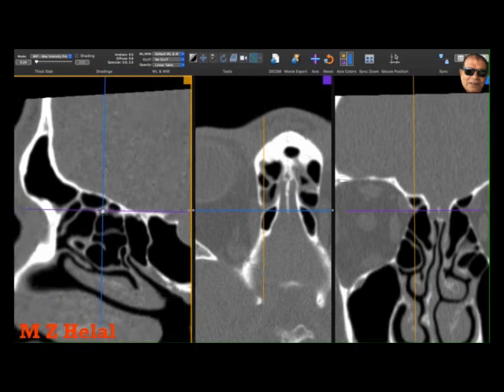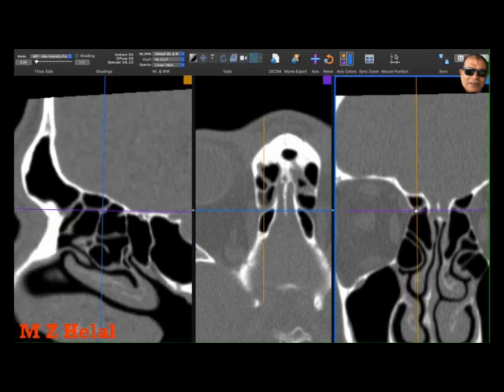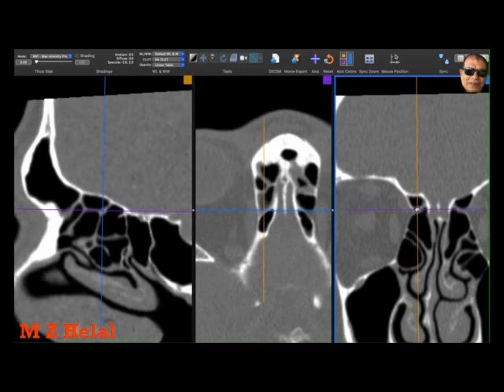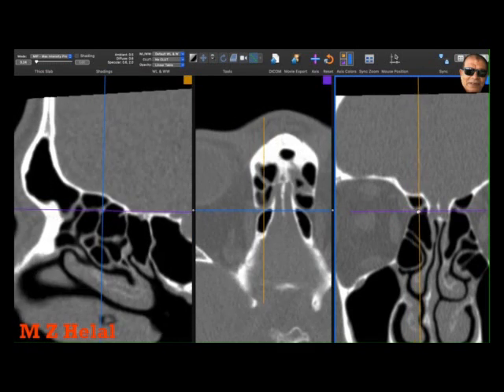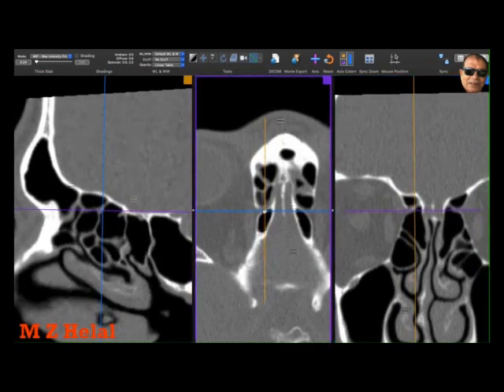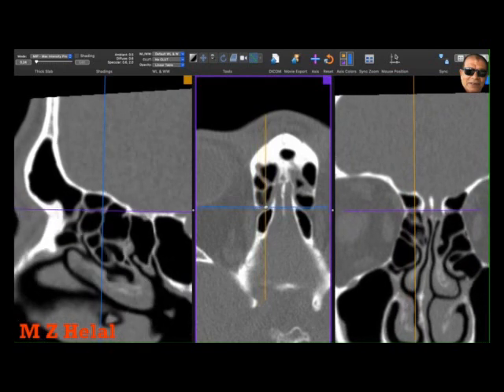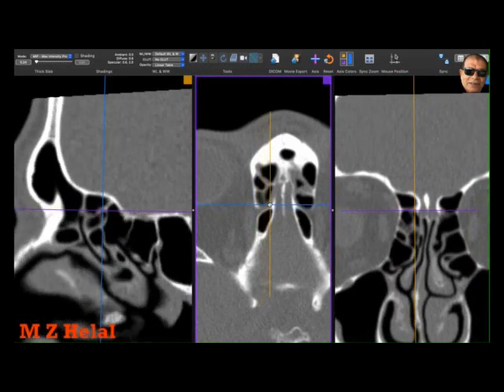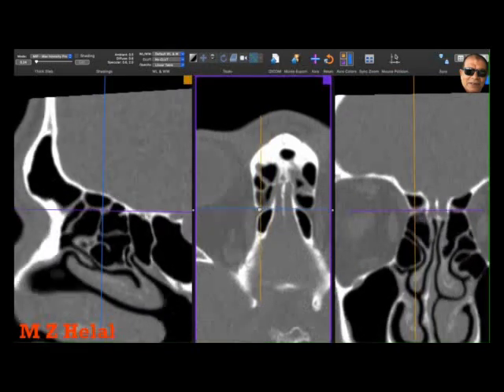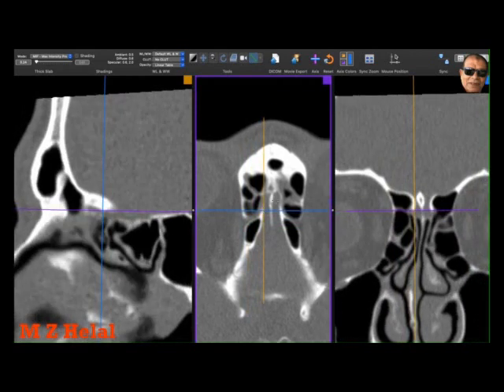This is the site of the anterior ethmoidal artery in a canal on the sagittal, running in a tree-like pattern. You can follow it also on the axial cut, from the orbit to the brain. Thank you.